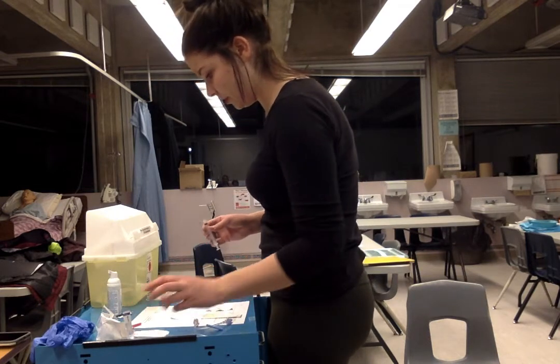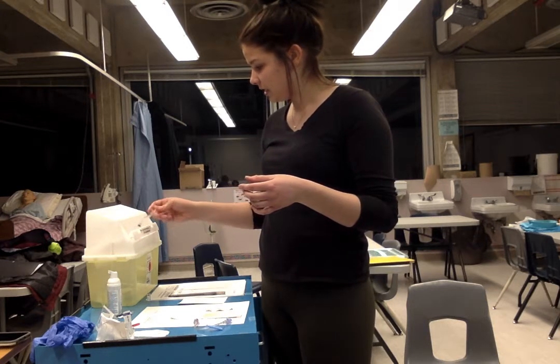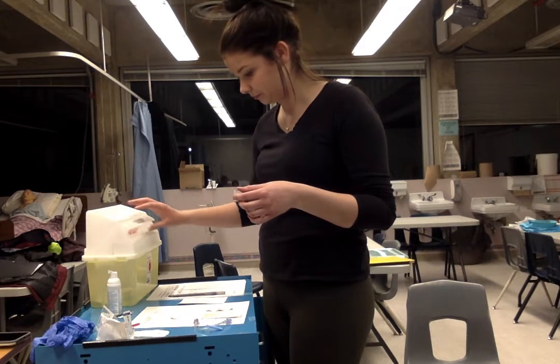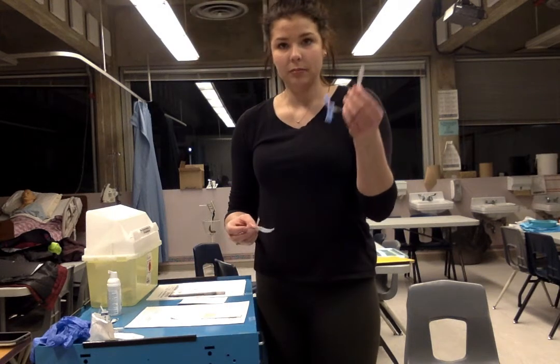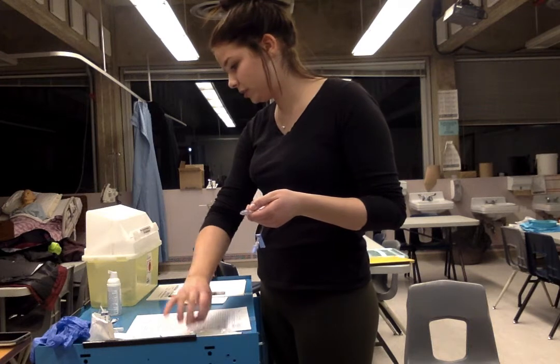All right, so my second nurse saw me do this. She saw what I was going to waste. So now we are good to waste that. We're going to empty it into the sharps. All right, so now I have my line ready to go. I have my label, and we are good to go into the patient's room.